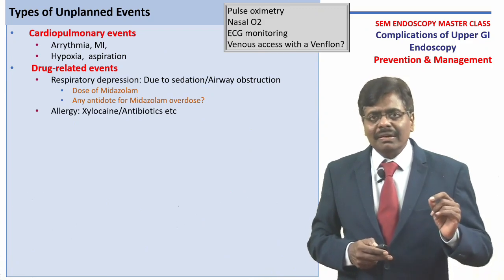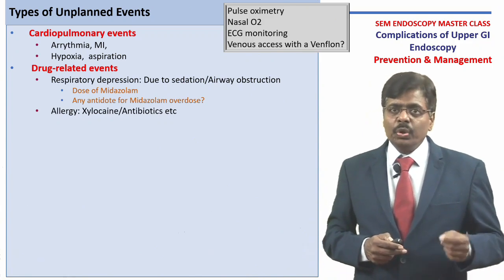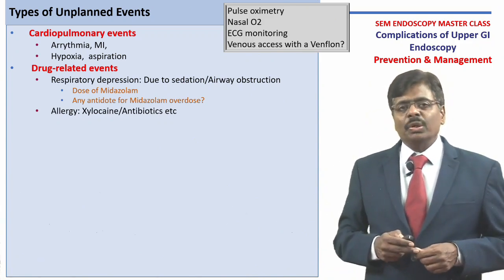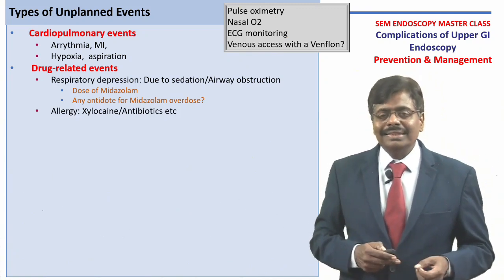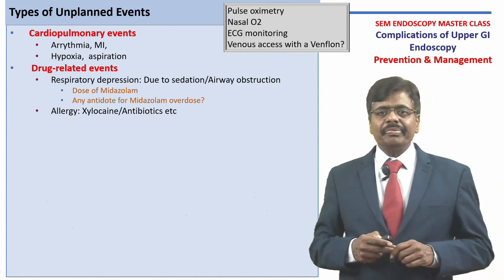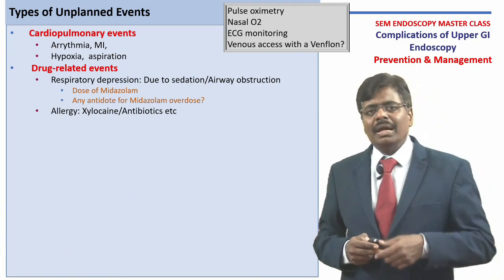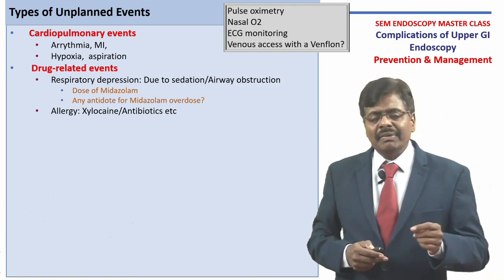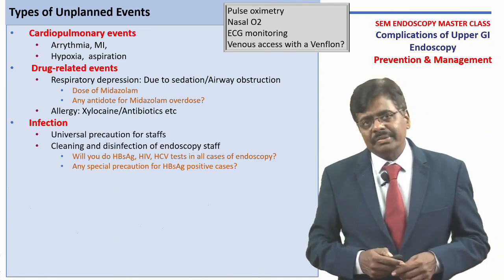It is not an analgesic. If you do any painful procedure, you may have to use other drugs like tramadol or more powerful analgesics later if required, but only in the presence of the anesthetist. The second thing is xylocaine 10% spray can be administered, provided it is given at least 5 minutes before, 2 squirts, to minimize the gag reflex.